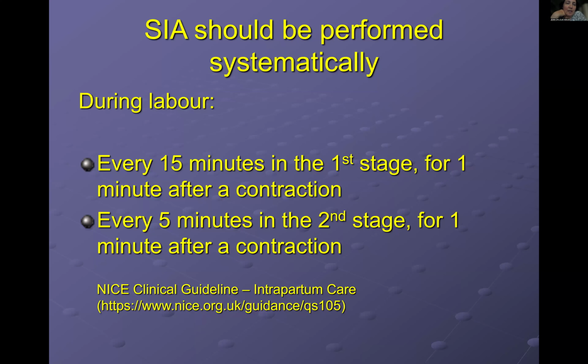So basically, what these NICE guidelines recommend is that during active labor, in the first stage, every 15 minutes you listen in for 1 minute after a contraction. As I said, you can use either the Pinard or the Sonicaid. Then during the second stage, where there might be a bit more room for fetal distress, you listen in more frequently, that is every 5 minutes for 1 minute after a contraction. So those are the recommendations.